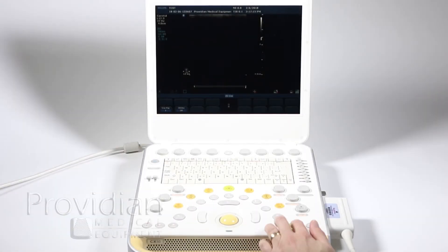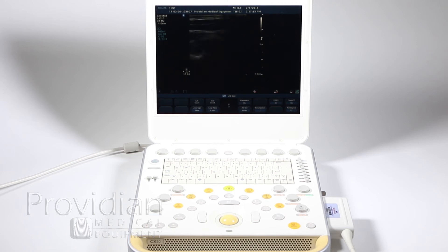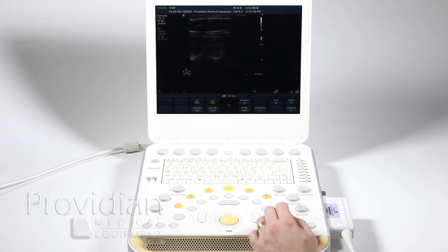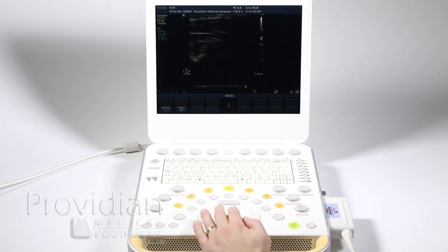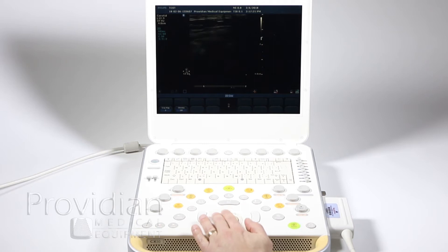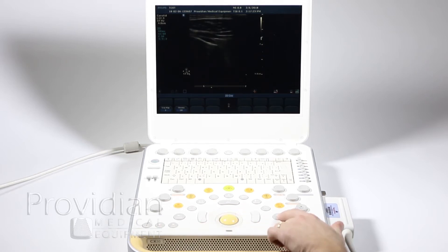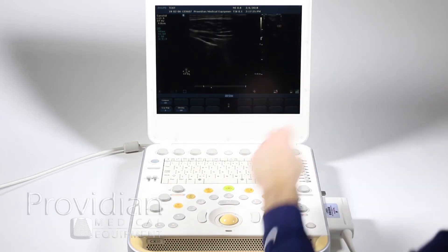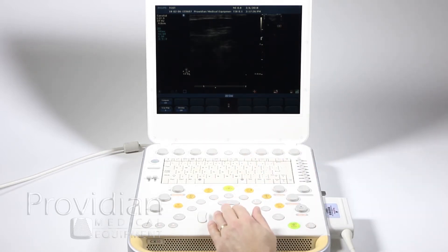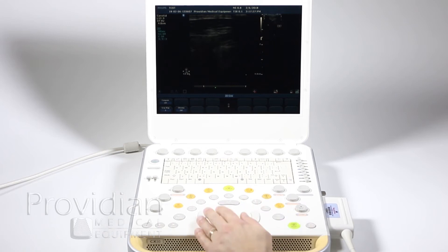If we want to go ahead and save some images, let's unfreeze and get an image up on screen. We'll freeze, and now you can scroll back through that image, hit Acquire, it saves an image, and you have your thumbnail up there.